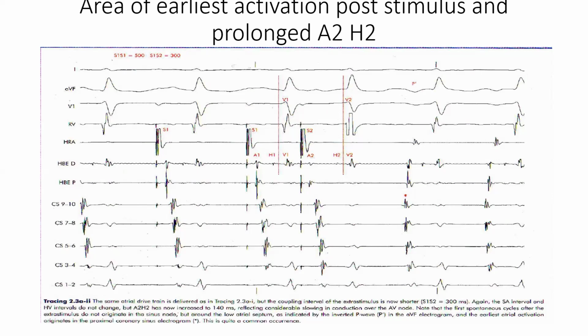For what I noticed is that, for this AH, you said the rhythm is supposed to occur with the P wave of the surface ECG. So remember, when they pace, it will pass through the AV node, right, to the ventricle. So when they pace here, look at this side. You can see my arrow, right? And you can see S1.